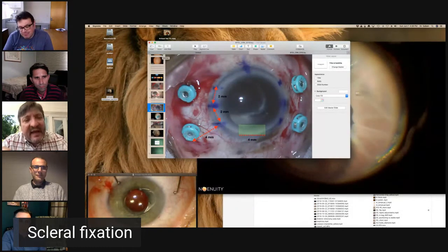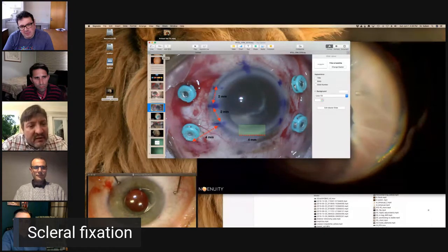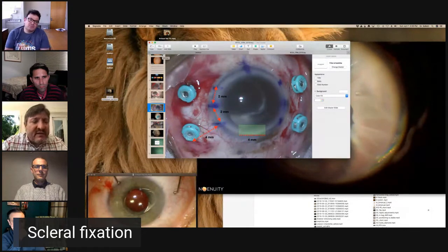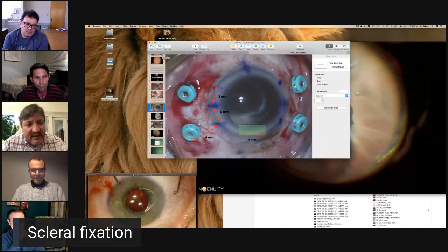And if it's a 14 millimeter sulcus, and you're 4 millimeters back from each sulcus, or maybe two or three, internally you're really creating artificial zonules. If they're too loose, you'll get a floppy lens that'll knock around and give you a UGH. And if it's too tight, you'll have the situation that I showed, that I had to fix in my case. There are some folks that have the knack and can get that tension just right, and the two of you obviously did it masterfully, and bless you for that.